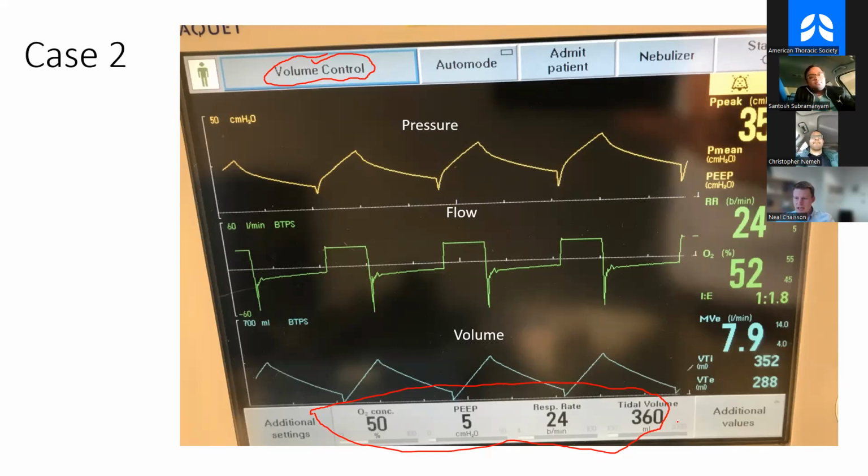So we enter that in the flow, which you can't see here, okay? And the monkey on the back end, or the physiology of the patient, is going to dictate the pressure at the mouth, okay? Now, there's a couple of variables that suggest that trouble is on the horizon with this patient. The first is that if you look at the peak pressure, it's a little bit high. So you're probably going to have a respiratory therapist coming to you pretty soon saying the peak pressure is high, okay? And when you go in the room to investigate, you should notice this expiration, right?